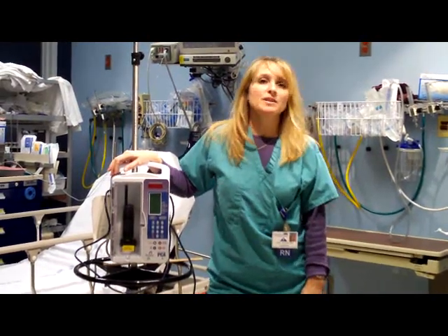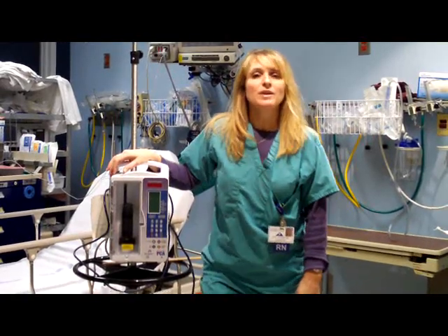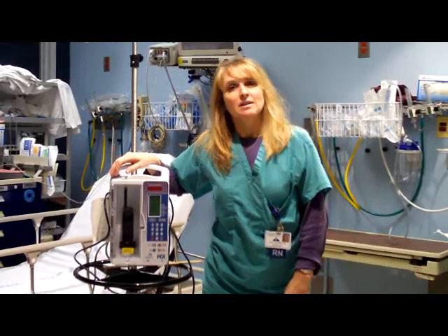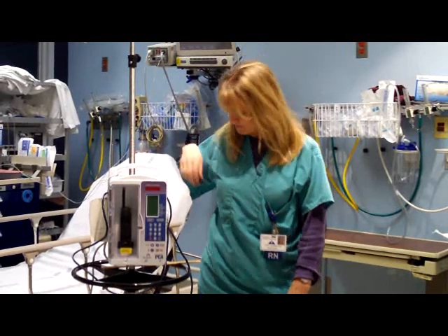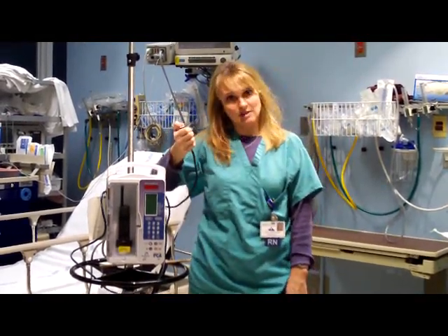The first component is the type of medication the doctor wants to order. The next component is if they want a continuous infusion of the medication or not. Then you have the PCA dose, also called the rescue dose, or the bolus dose, which is used when the patient actually presses the button.